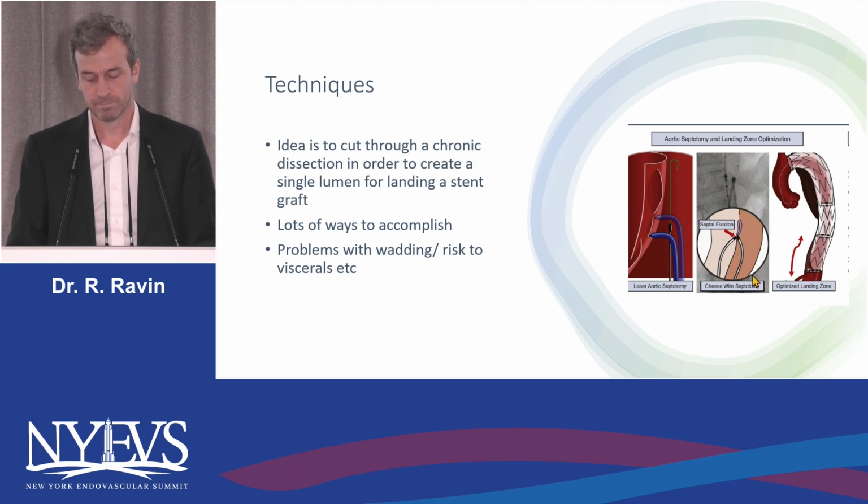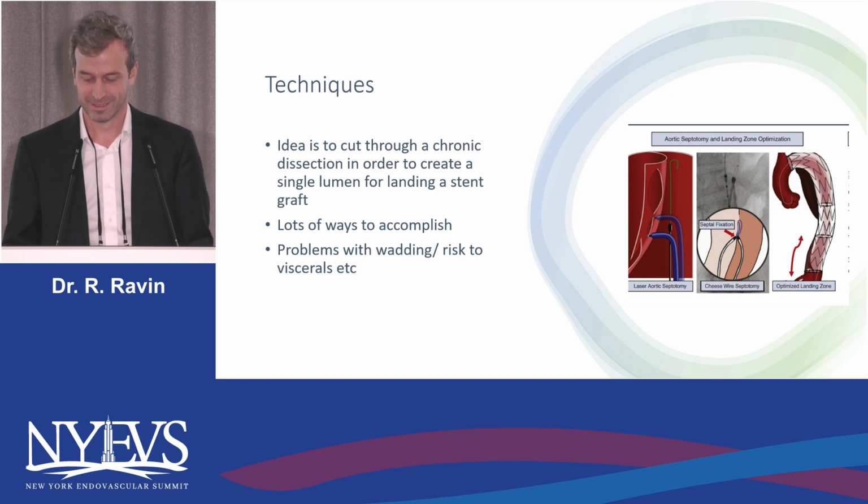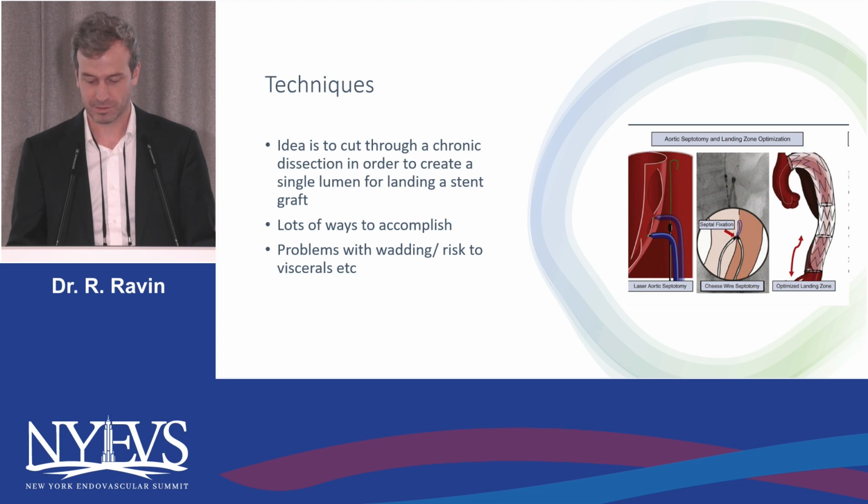which I can tell you the idea of the cheese wire never made much sense to me because this is not cheese. This is a septum that has calcium in it and fibrin, and it wads. It doesn't really cut, and then you end up with a wad of septum that occludes your aorta at some arbitrary point further south. So I think these cutting ideas have some merit to them, but they sound fairly terrifying, and I have not done them yet, but I would love to hear if other people in the room can comment on it.